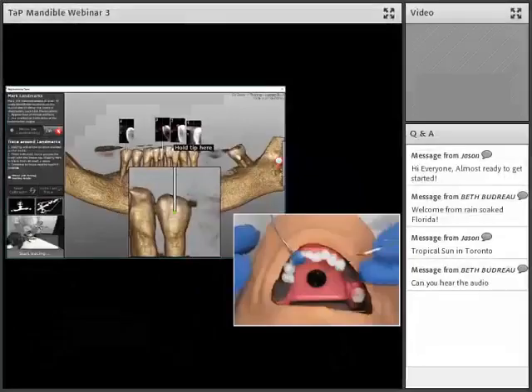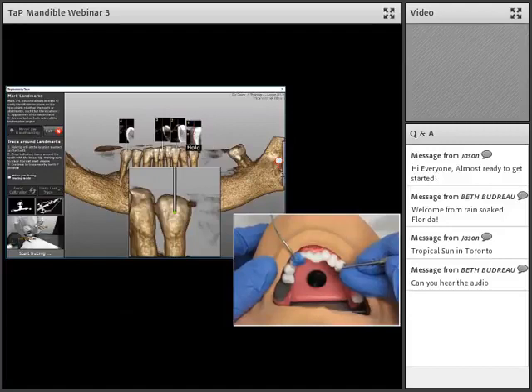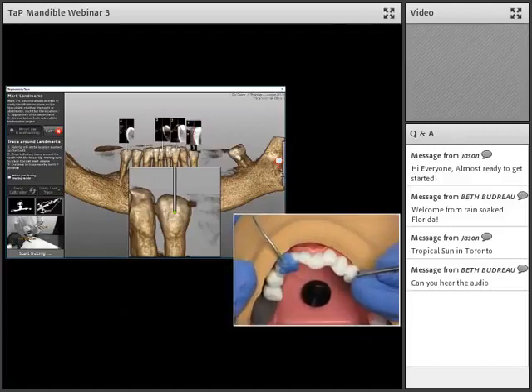And I trace by sliding the ball tip over the surface of the tooth, on at least 3 sides of it, buccal, occlusal, and lingual. As I trace, the points are being collected. 100 points have been recorded for this tooth, so I move over to the next landmark.